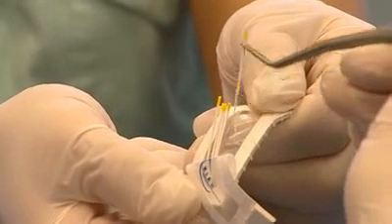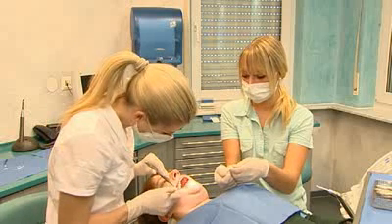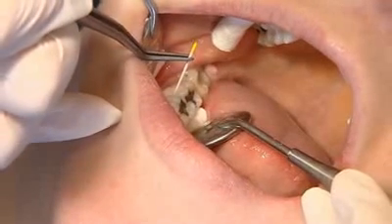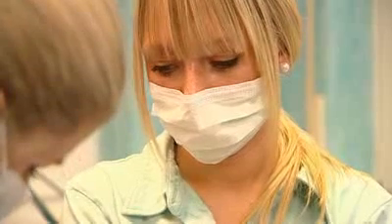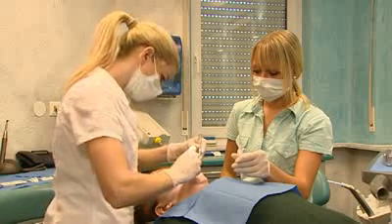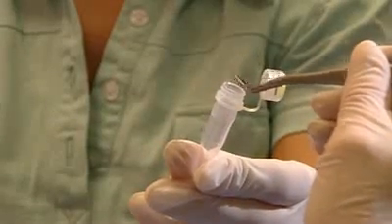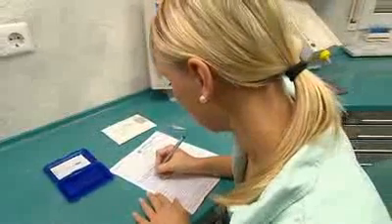In other cases, such as the presence of local recurrence or residual pockets, it may be useful to determine the bacterial load of individual gingival pockets. For such an analysis of individual sites, specimens are taken using 1 paper point per sulcus. Up to 4 individual site tests per patient can be requested in one order. In order to avoid specimen mix-ups, the tubes are color-coded. Assign each specimen site a color-coded tube and note this on the order form.